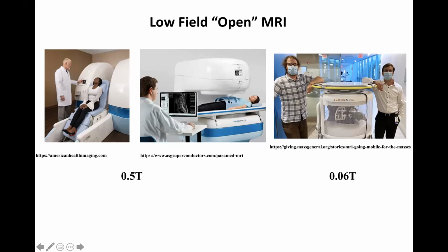So here, when you're lying down, your spine can be in a different conformation than it can here. And if you wanted, you could create a platform here to stand on and look at your knee under force and things like that. So these usually run at half a Tesla or lower. Many of them are at 0.35 and 0.2 Tesla, these open systems.